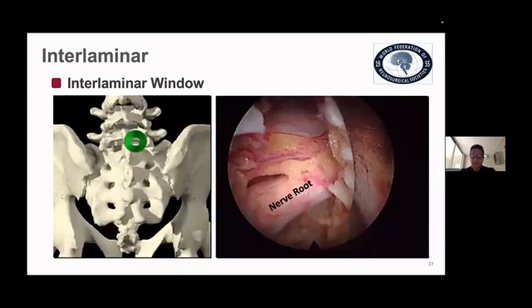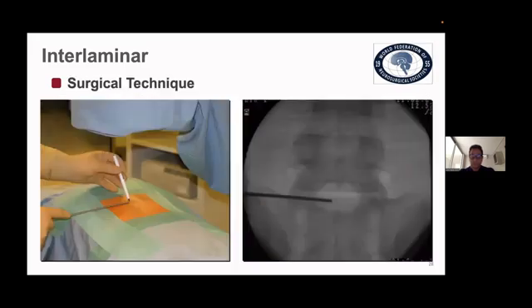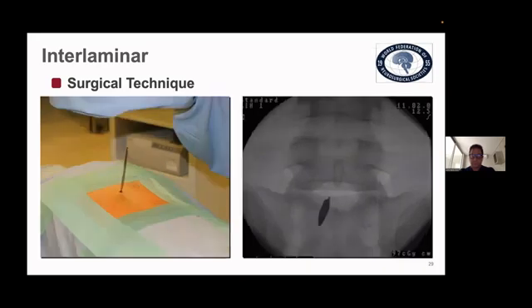This will be the view by opening of the flavum ligament. You see the dural sac and the nerve root. For the surgery, with the patient in the same prone position, we mark the window in the middle of the flavum ligament, a couple millimeters away from the midline in order to avoid any conflict with the spinous process. We perform the skin incision of approximately 7 millimeters, and we have to be sure that we also open the fascia of the muscles.